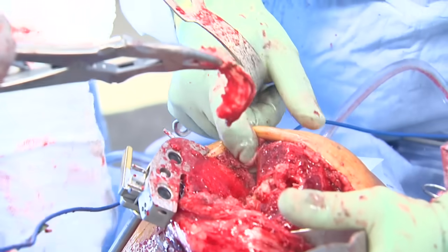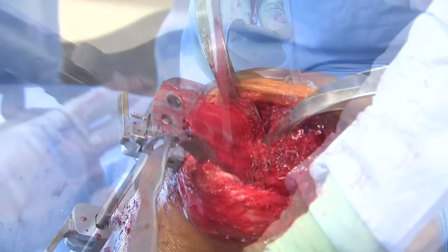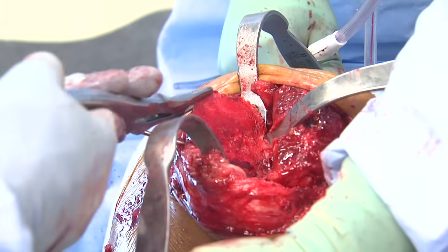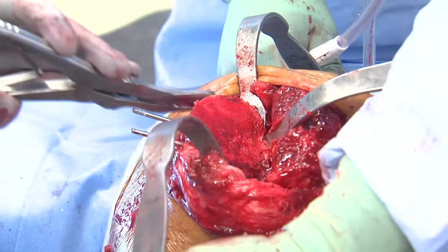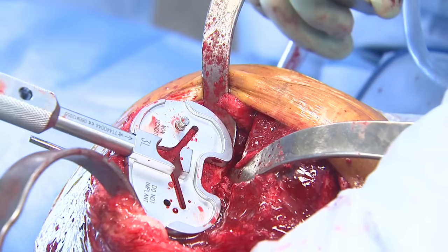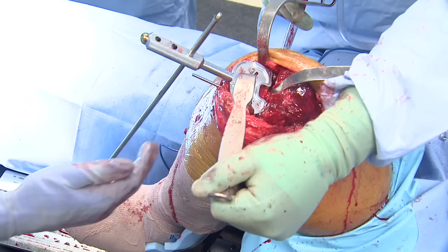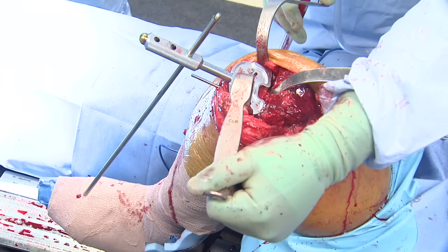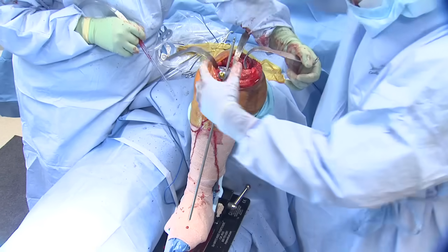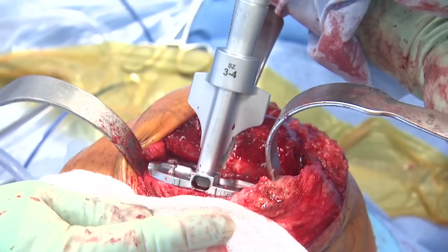Meniscal tissues from both medial and lateral compartments are subsequently removed. The extramedullary cutting device is removed and any bony osteophytes remaining on the proximal tibia are addressed appropriately. The proximal tibial punch guide is placed in an appropriate position and an extramedullary drop guide is used to confirm appropriate rotation as well as coronal and sagittal alignment. Once its position is confirmed, pins can finally be removed and the tibial punch made.